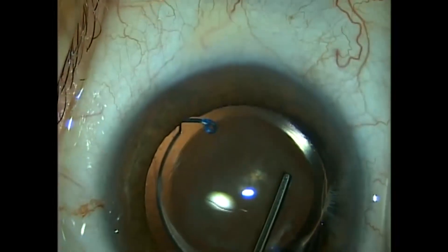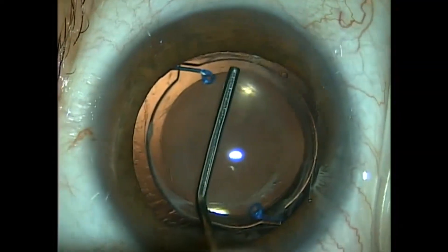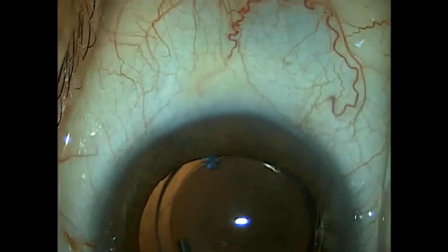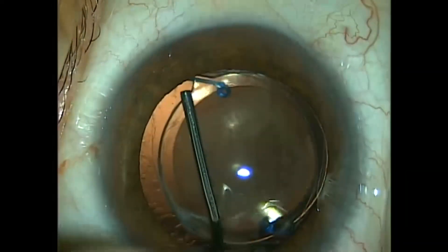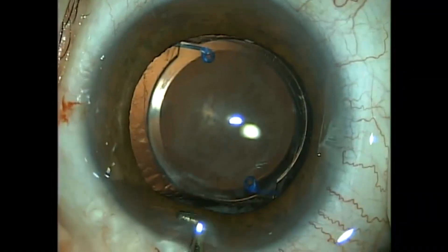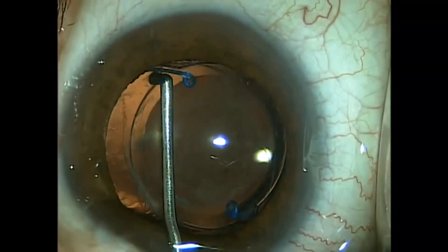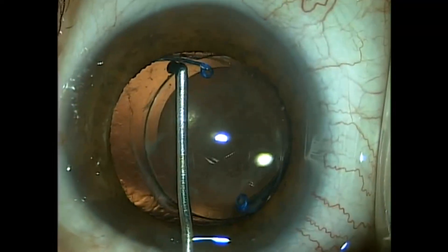The plan was to take out his silicone lens and exchange it for an acrylic lens. We're doing this under topical anesthetic. We fill the eye with HELON GV and try to separate the anterior capsule leaflet from the lens surface. I try several different instruments to get an idea of how fibrosed this lens is to the capsular bag. Keep in mind, he does have an open posterior capsule from a prior YAG capsulotomy done two years ago.